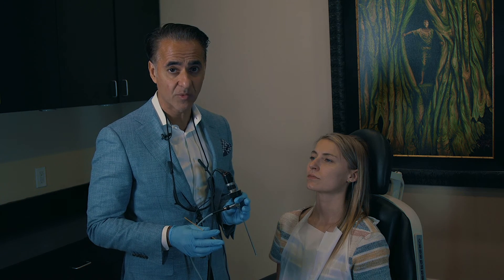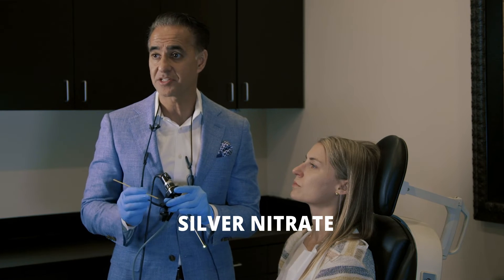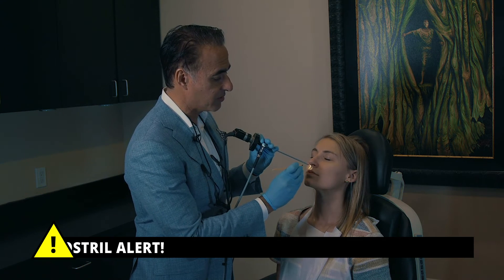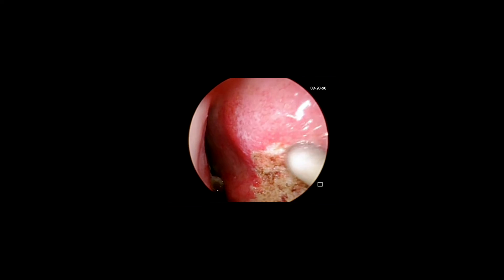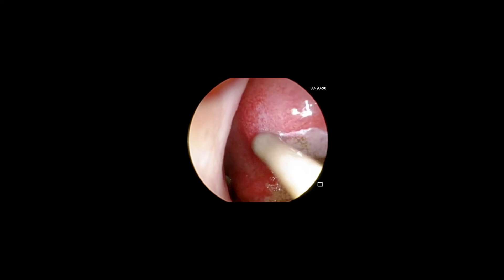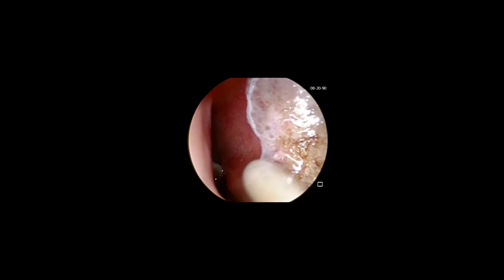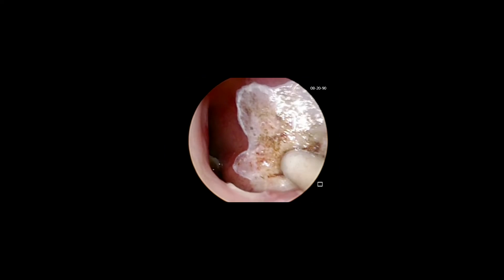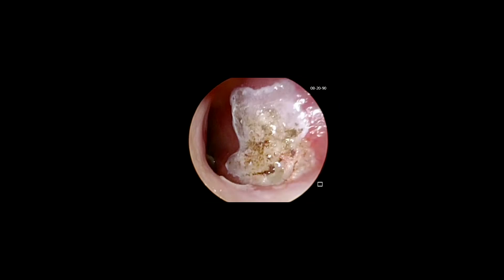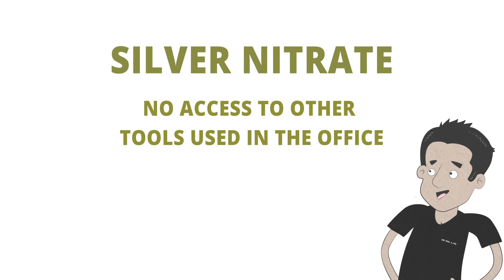Now that we've controlled the active bleeding, we're going to utilize a different technique to cauterize. This is called silver nitrate, which is chemical cauterization versus electrical cauterization. Using an endoscope, you can see here in the very front we still have some areas around that original cauterization point that are still prominent with very active vessels, which are probably contributing to the bleed. We're going to roll this silver nitrate around that area and flatten it out so that it seals those vessels. She's not feeling a thing — this is very easy and simple to do. What's nice about this technique is that it can also be done at bedside if you're in the emergency room and don't have access to everything we use in the office.